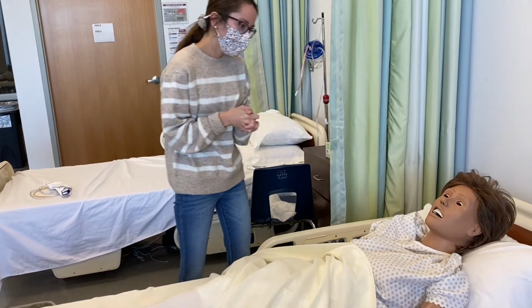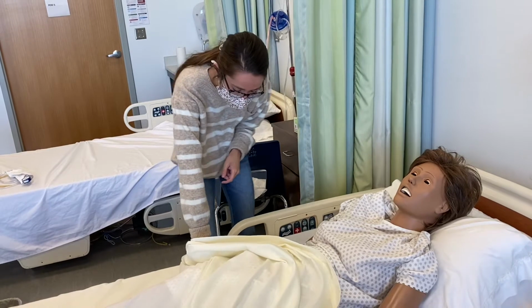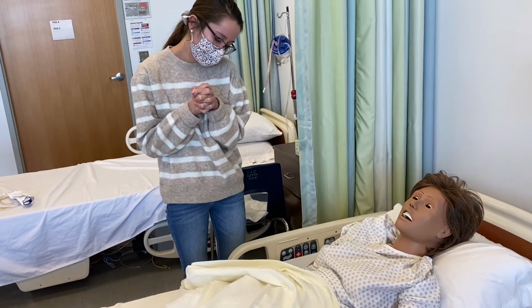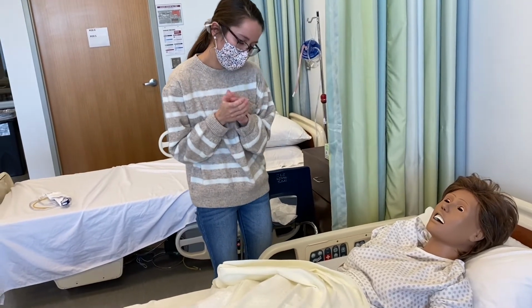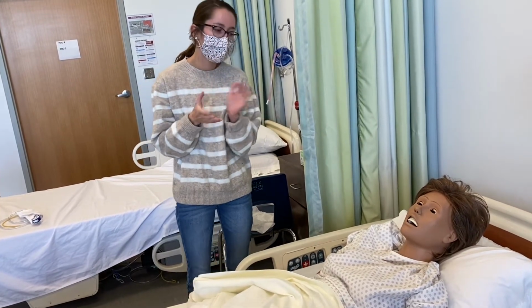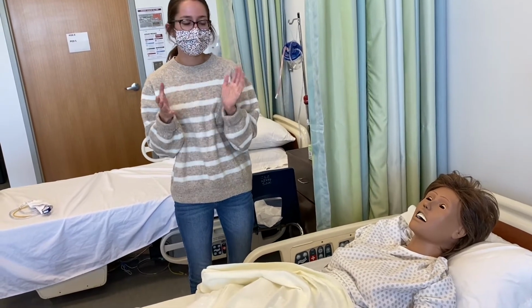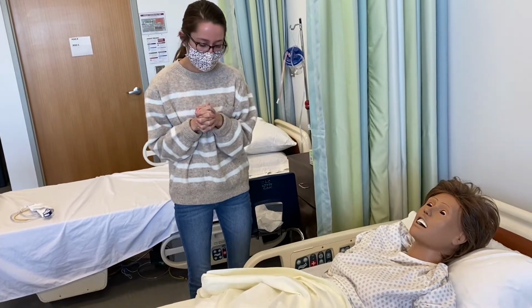I'm going to verify their name and date of birth. So this is Carl Shapiro today, and his date of birth is 7/19/19XX, and he would verify that with me. I'd ask him if he had any allergies, and he would tell me he has none today. I'm going to explain to Carl why we are inserting a catheter, why it's necessary, and how he can help cooperate with the procedure today.